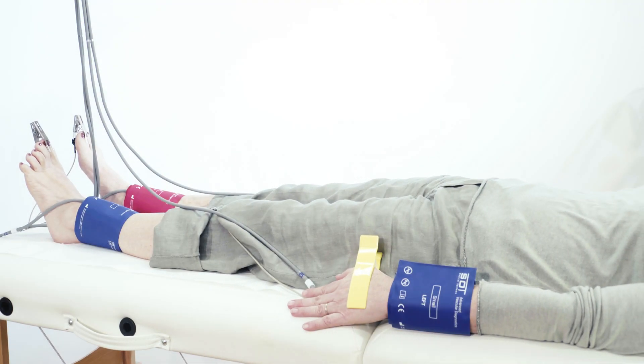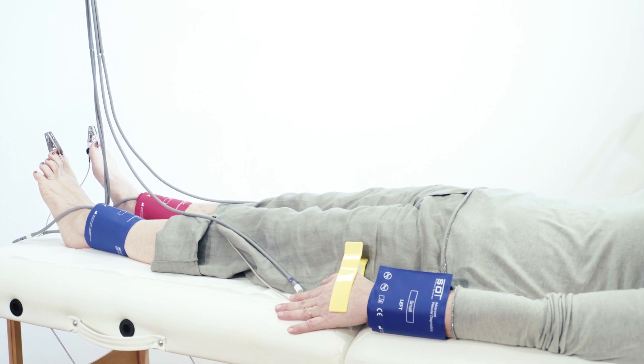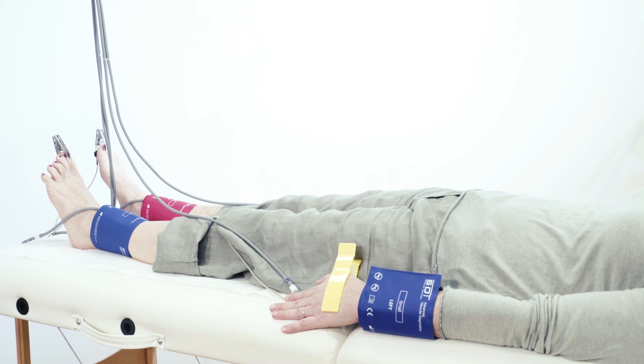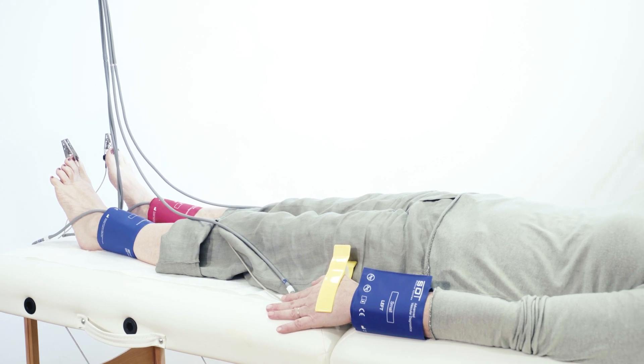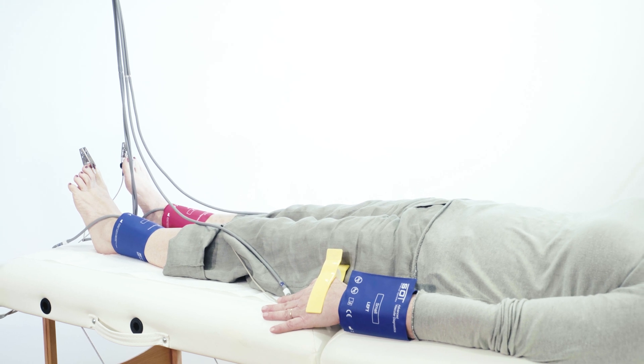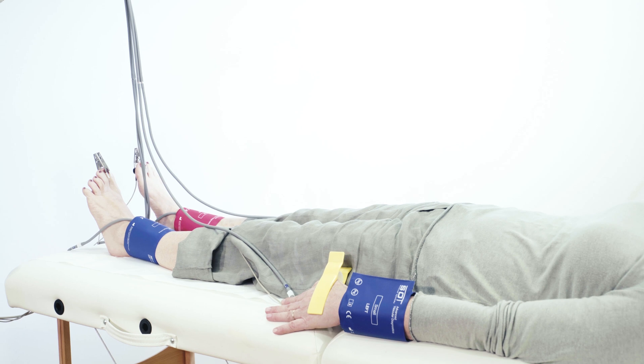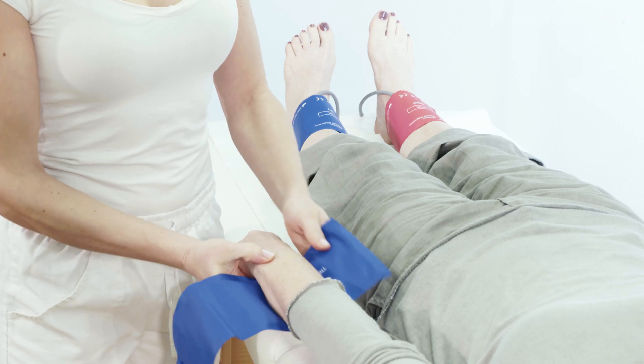The H-top method allows simultaneous measurement at up to six measuring points with four measuring cuffs and two optical sensors. This enables detection of circulatory disorders of the large vessels and determination of circulation in the forefoot and toe area.